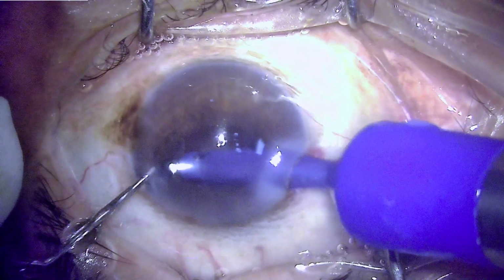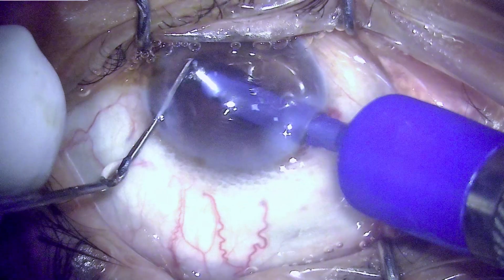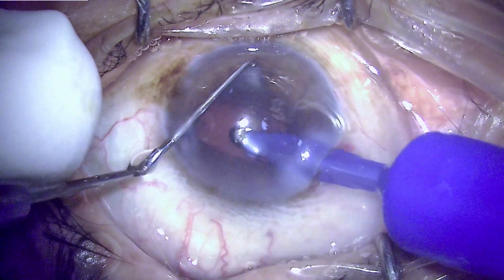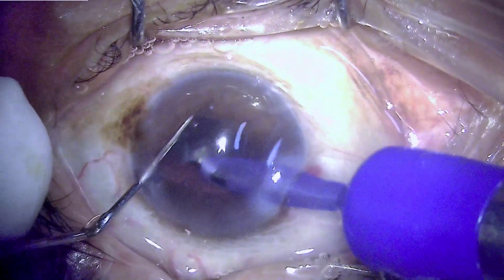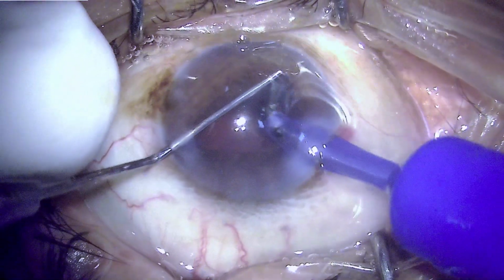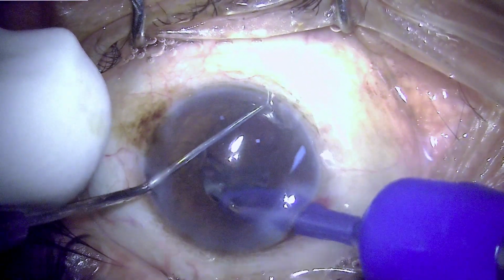If not possible, then one can always resort to using another tool which can retract the iris in various quadrants, so that one can engage the epinucleus and mold or bend that bowl so that the margin is available at the center to aspirate, hold and remove.